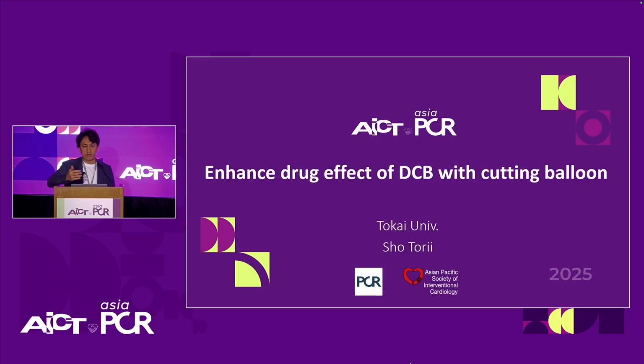So my talk is here. Dr. Naltip demonstrated the very acute result of this cutting balloon, so acquiring lumen gain, preventing severe dissections, or making a crack in the calcium. So I'm going to have a presentation about what happens after that. In acute gain or acute result, we know it. There's evidence, and we know that the cutting balloon works well for it. So how about the next one? Can this cutting balloon and DCB usage enhance the drug effect after the DCB?